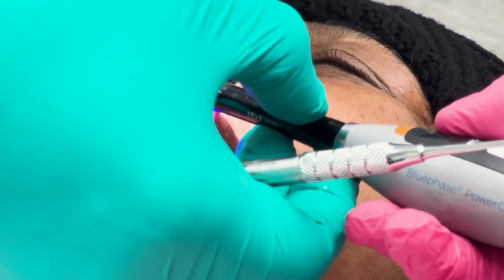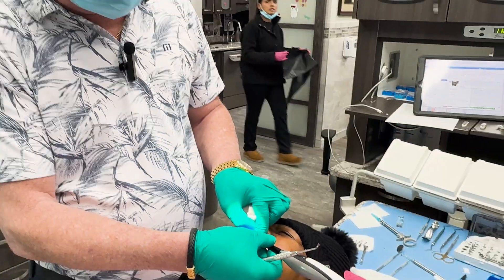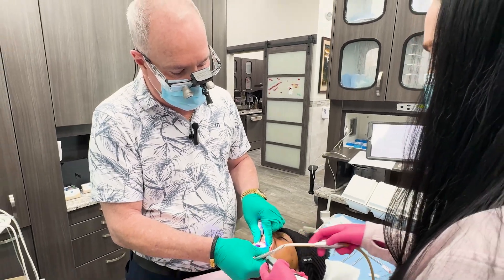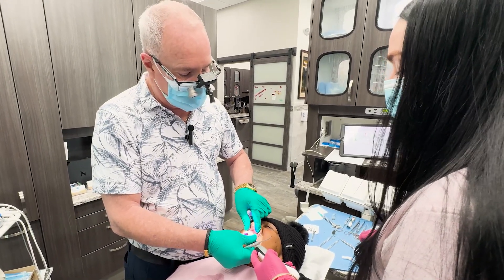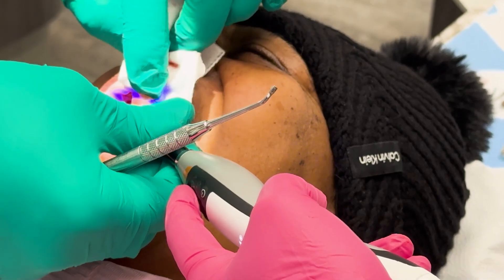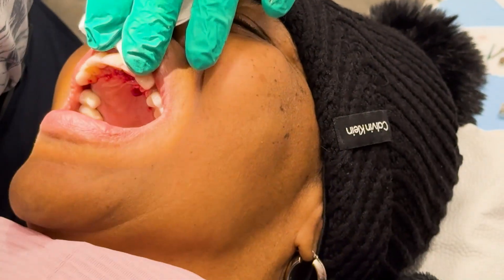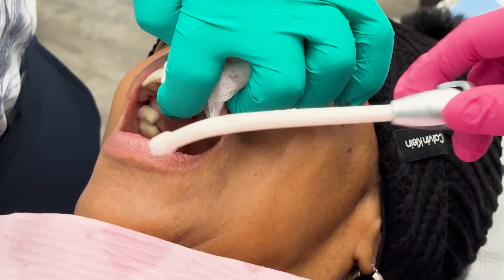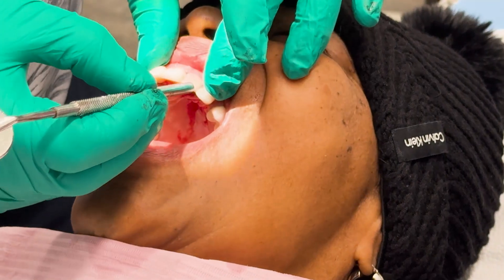So in a matter of minutes — maybe 10 minutes — we extracted her tooth, placed a mono 3mm by 13 implant, packed it with the Shacken First bone plug product and the Hemostip gauze, and made a temporary tooth for her. I don't know any other implant system in the world where you can do such a thing in a matter of 10 minutes and have a patient all finished and ready to go home. I've been doing this 35 years and I've never found anything better than the mini and mono implants. We've got that all done nice and solid.